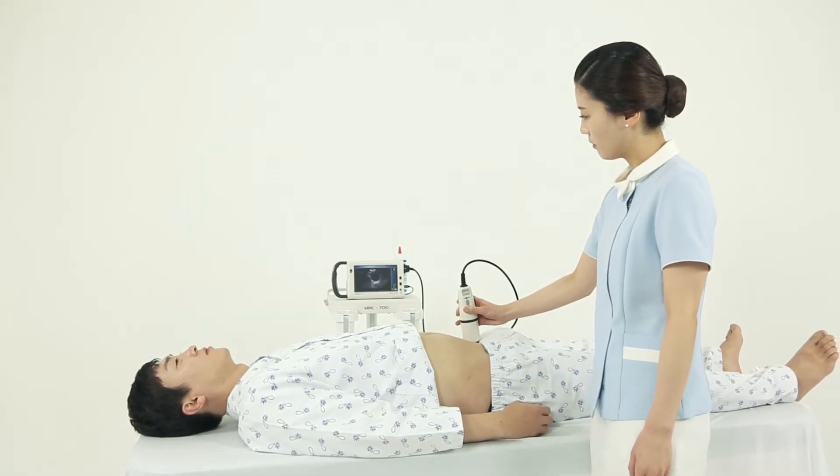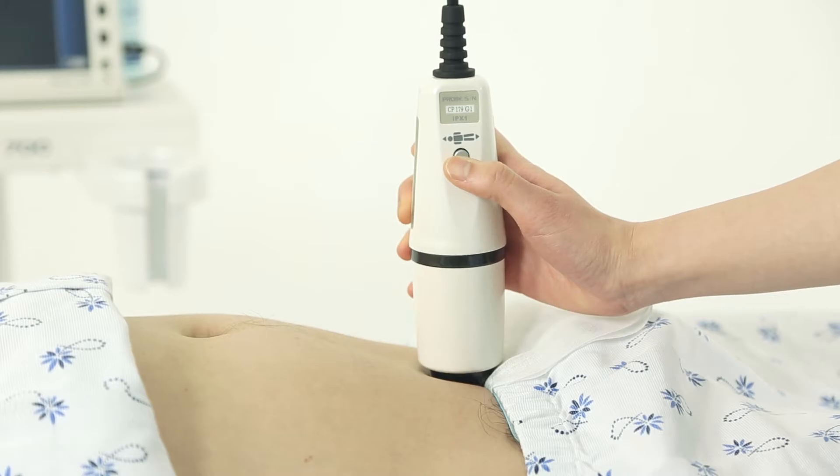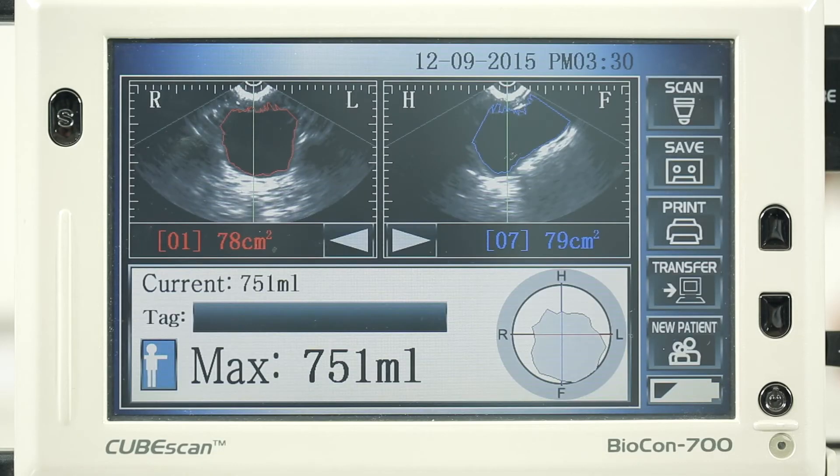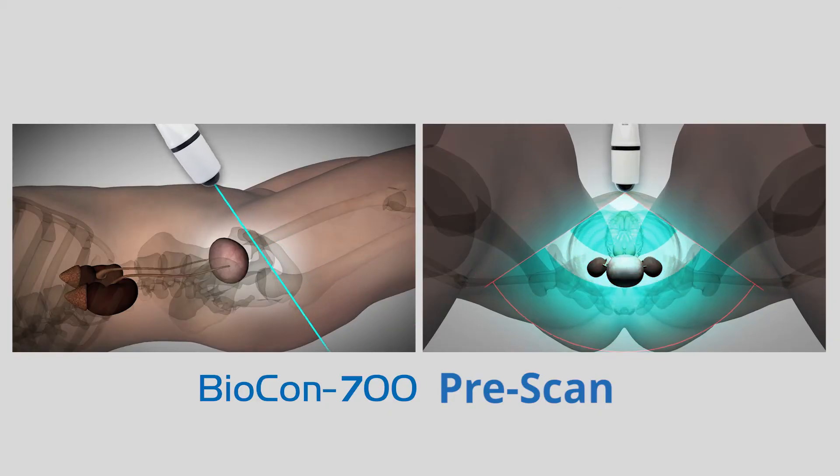If you press the scan button again when the bladder is at its largest size, the residual volume will be calculated. Locate the bladder along the median on the screen as shown in the image, then press the scan button.